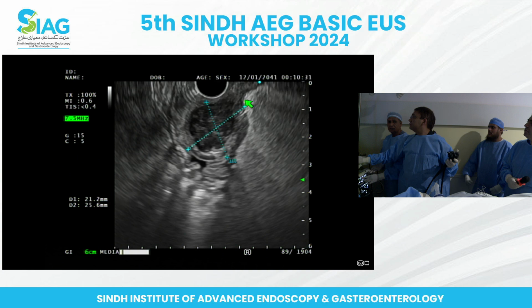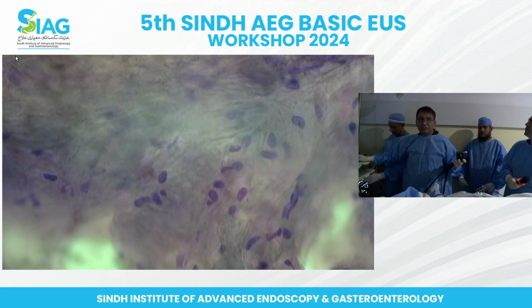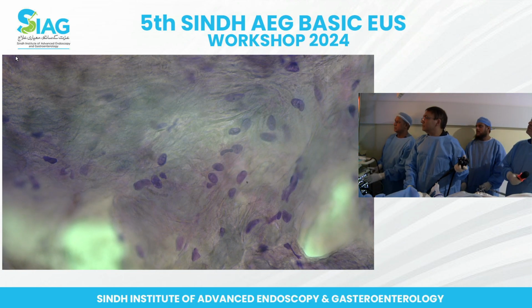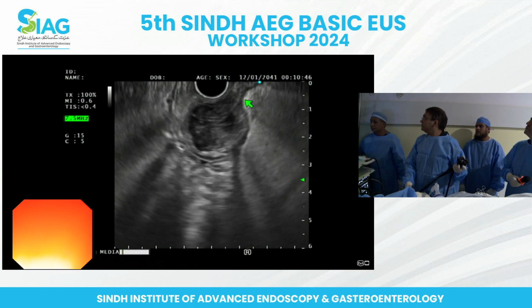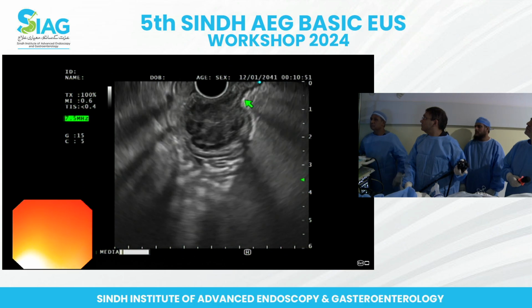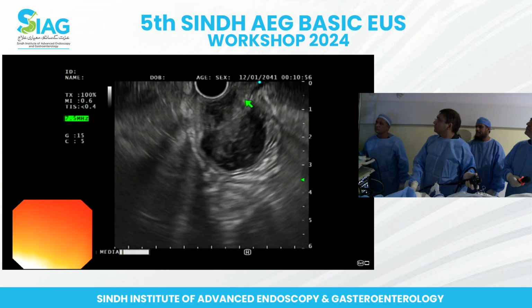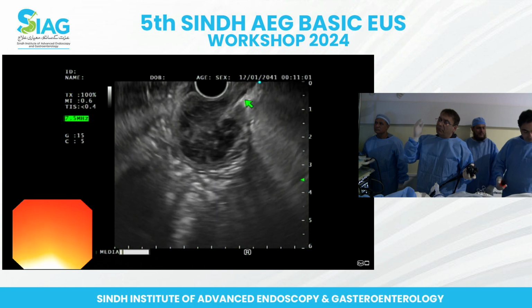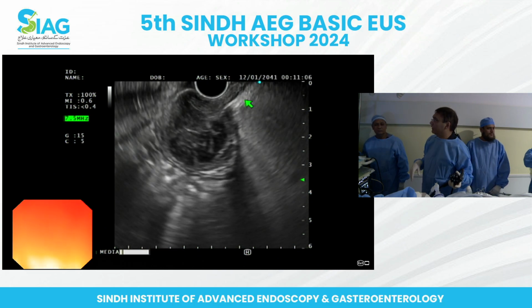Picture, please. I think that's one of the key things with submucosal lesions, that you want to see where the lesion is and where the entry point of the lesion is from the normal wall. You see there, that's where you want to see the separation of the layers to figure out which layer it's coming off of. And you can do that at the proximal extent or the distal extent, depending on where the scope lines up best. But the point is, you have to keep your mind open about any possibility, any type of lesion. Okay, good.